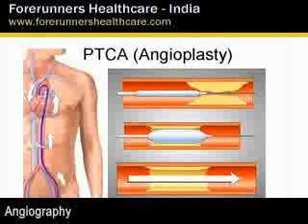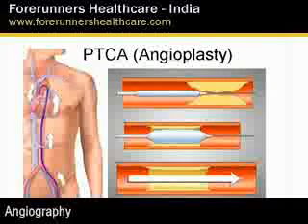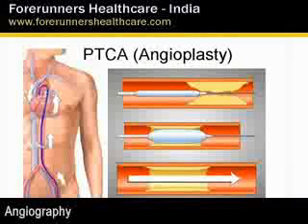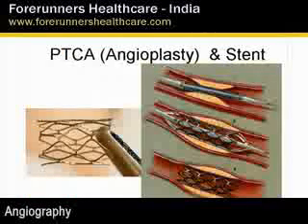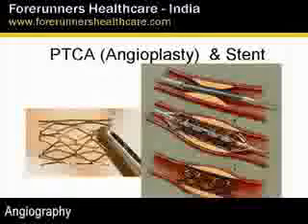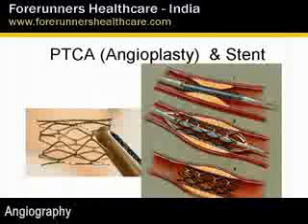Angioplasty has the inherent disadvantage that after some time the chances of re-stenosis, or the blockage occurring once again, are rather high. Therefore it's not a permanent kind of treatment. So initially we gave it a thought: how can the results of angioplasty be made to stay longer? So therefore this particular invention known as a stent came in.